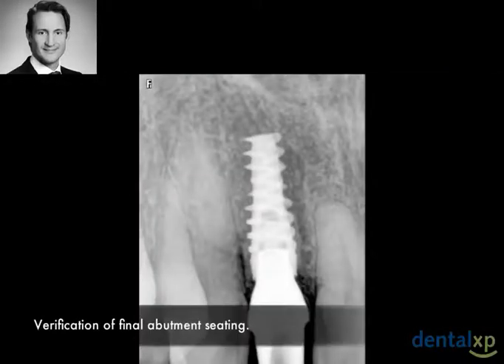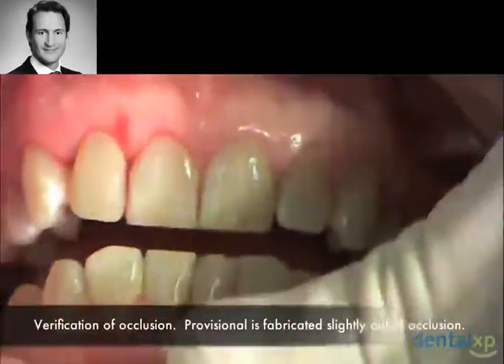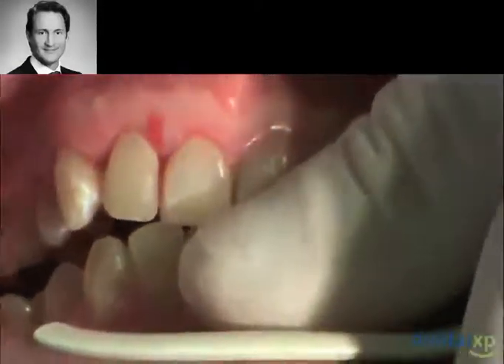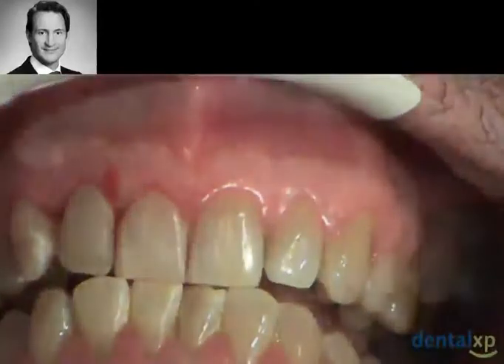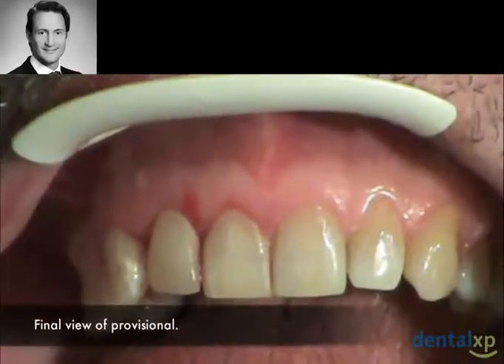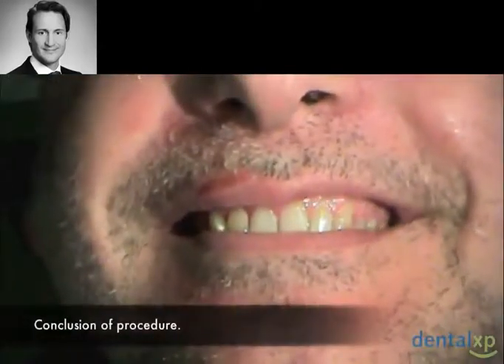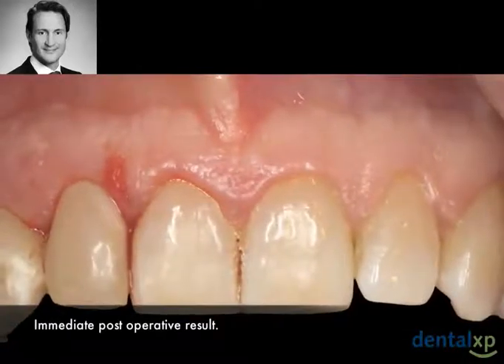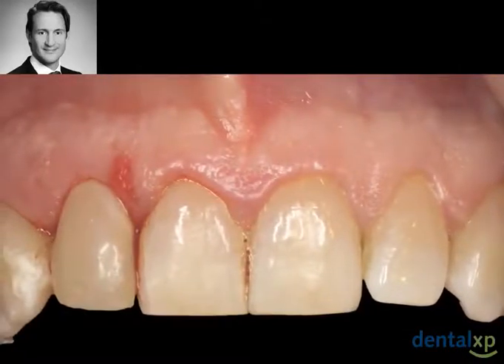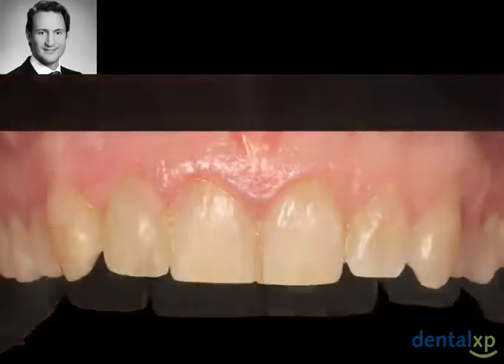Next, a final radiograph is taken. At this point, occlusion is verified, and note that the provisional, when the patient goes to excursive contact, is slightly in contact, and that will be relieved. Here's a final view of the provisional and the conclusion of the procedure. Here's a close-up view of the tissue support and site after the provisional and at the completion of the procedure.